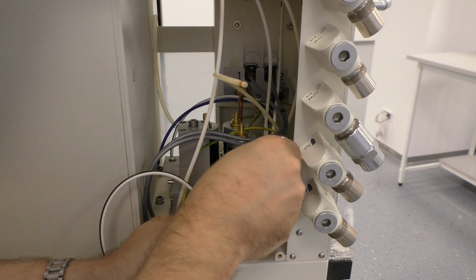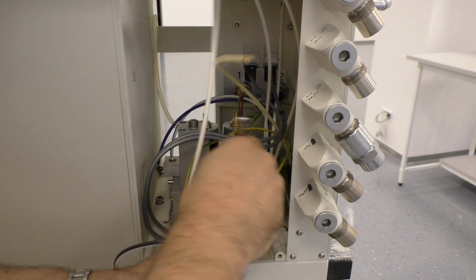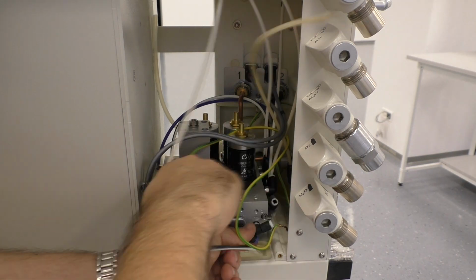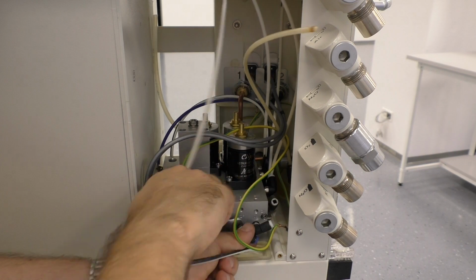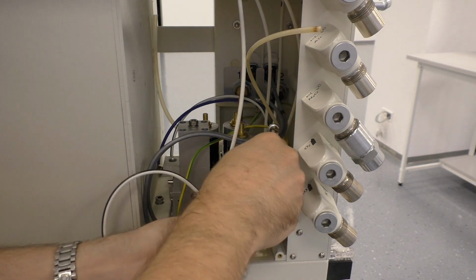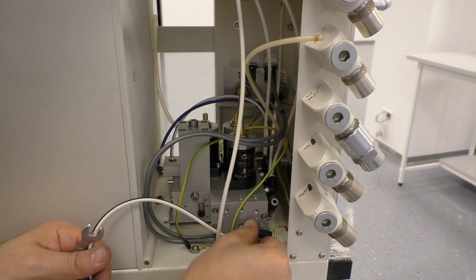It's like playing Lego and everything is for free. Yippee! I will put them in my big collection of pneumatic parts. And maybe the next device I will build is something with pistons and pneumatics, which is quite nice. So the last one comes out easily.